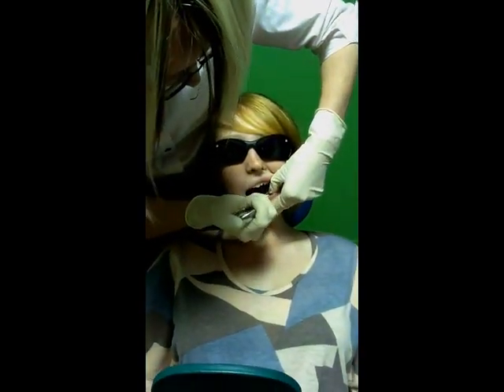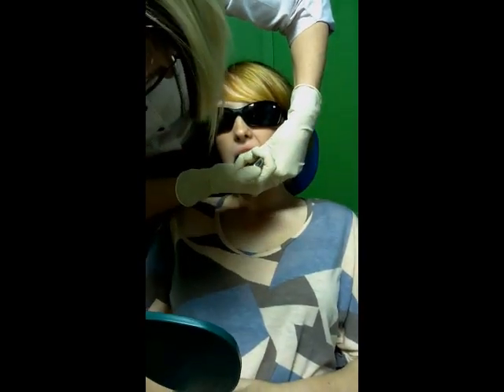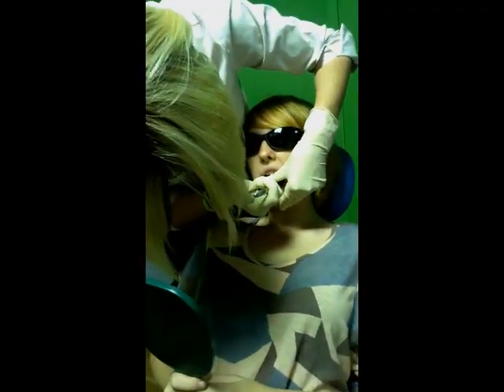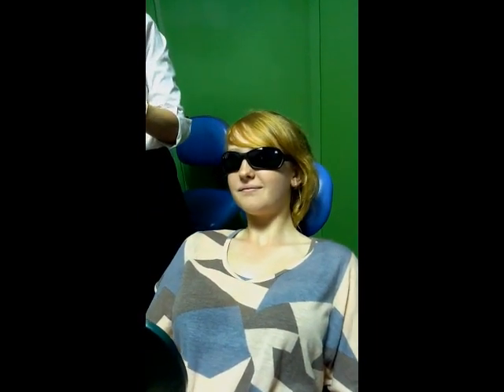We may not need one here, Shay, because you've had that baby tooth out, but that fits in there. Because your adult tooth is still coming through, it's not all the way through yet. So we don't need to make too much space there. We'll just go to the other side now. Same thing there, Shay — your adult tooth is still just coming through, but we can put one in there. Nice and big for me. You can sort of hear it when it goes between, can't you? Yes. That's all of the bottom ones done.